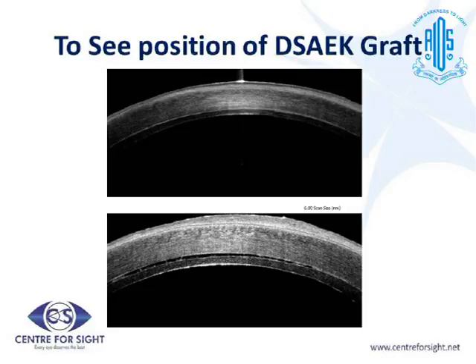But in this particular patient, on day 1, on slit lamp, we were not able to visualize the graft because of corneal edema. And then we did the anterior segment OCT, and that showed that there was a central detachment of the graft. So that was the reason for the marked corneal edema. We did rebubbling on the same day, and this is the post-operative OCT scan showing very nice attachment of the graft, and there was complete resolution of the corneal edema.